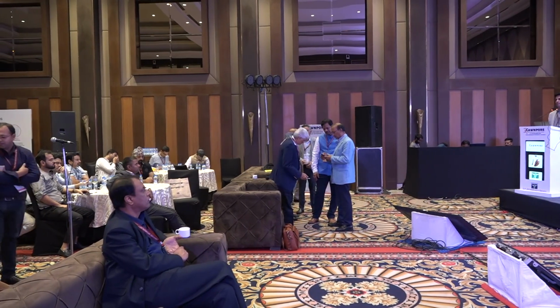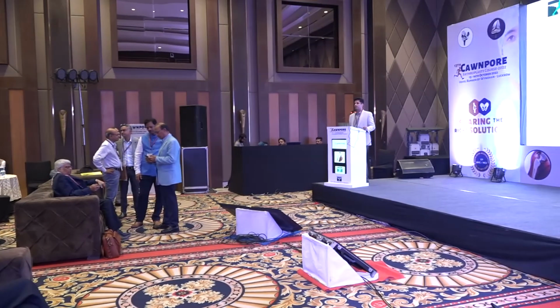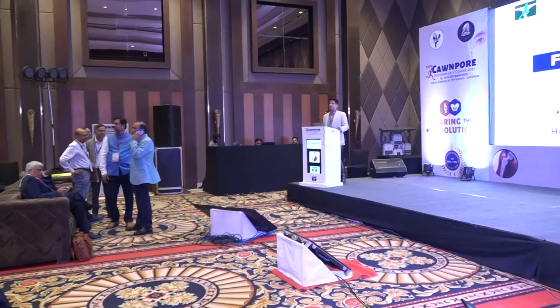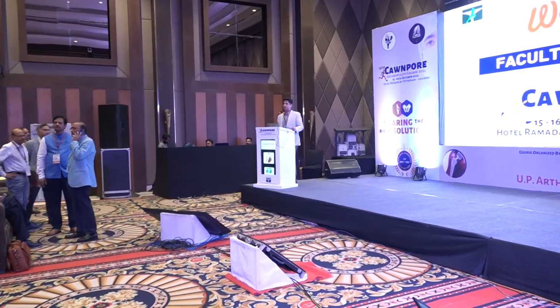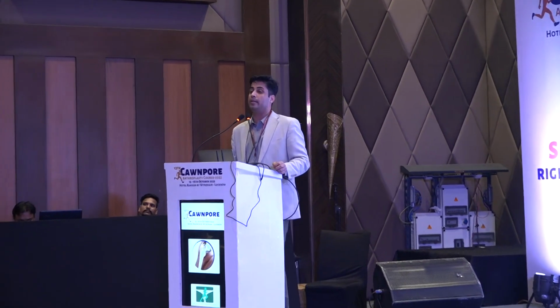See, you have to understand that not all implant companies provide all different sizes and shapes and diameters. So you have to already do that homework and catch on to a local manufacturer, and then ask the exporters, the DePuy, Synthes, and Stryker people, to provide you with the proper sizes. Otherwise, you'll start using the local ones. So threaten them a bit. That's the only way it works. If you ask them, they'll provide it to you. And this is not an emergency. You can plan the surgery and do it.